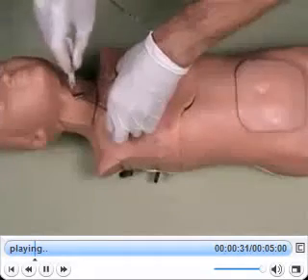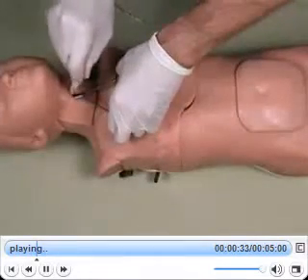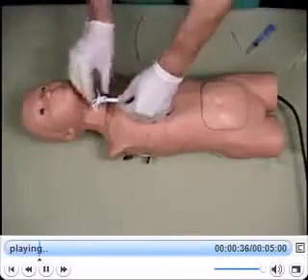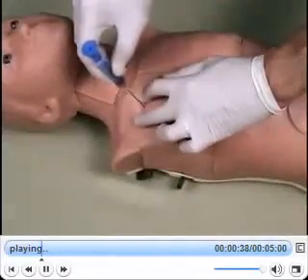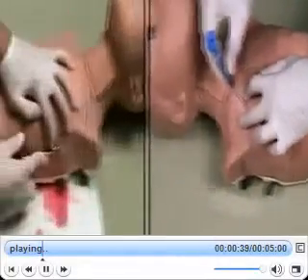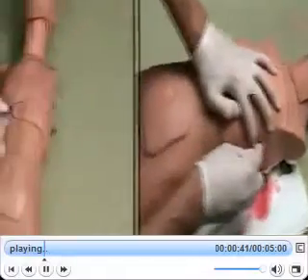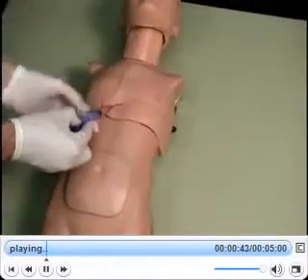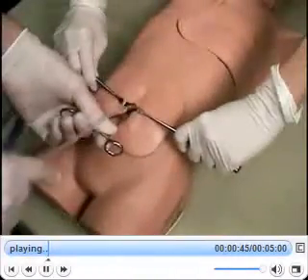Like Trauma Man, this lifelike simulation can be used to practice cricothyroidotomy, tracheostomy, needle decompression, thoracostomy, pericardiocentesis, and diagnostic peritoneal lavage.